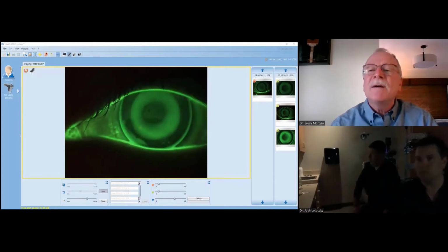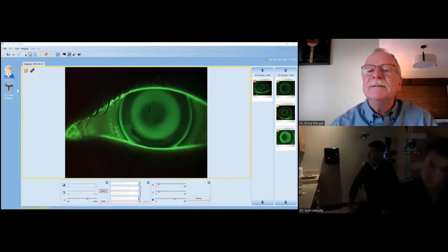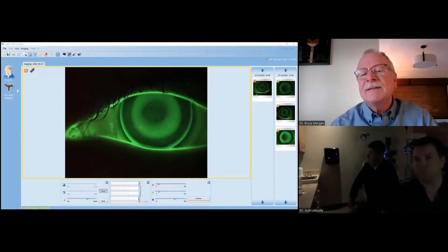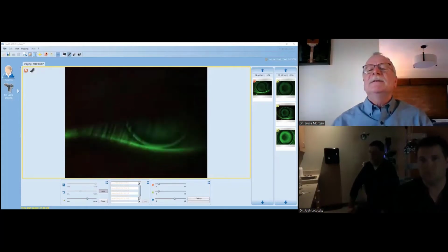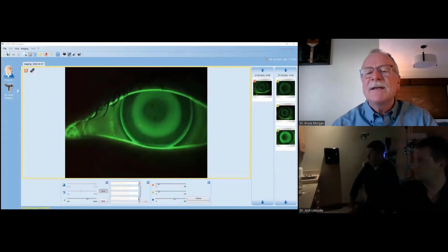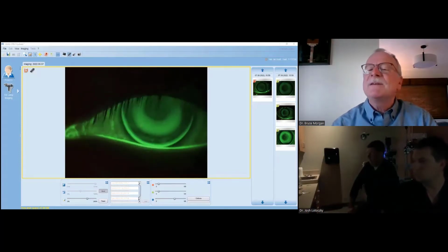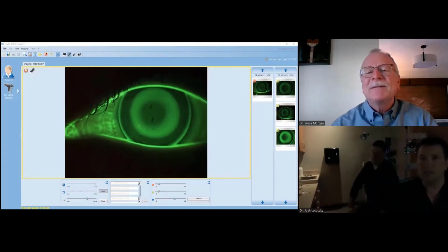And there are going to be some high-powered myopes that want to try orthokeratology, and you might fit them off label and come up with a fluorescein that looks like this, that you would say, well, I might let them sleep in this a night and see if it centers up. Because once you have things centered, then you're really in pretty good shape as far as making changes. But I would agree, I would be on the fence about dispensing. If this was a one diopter myope, I wouldn't dispense it.